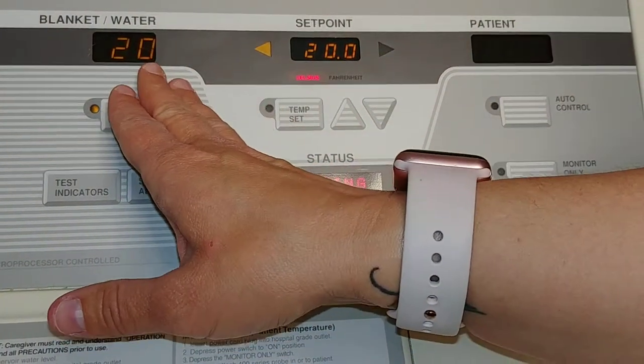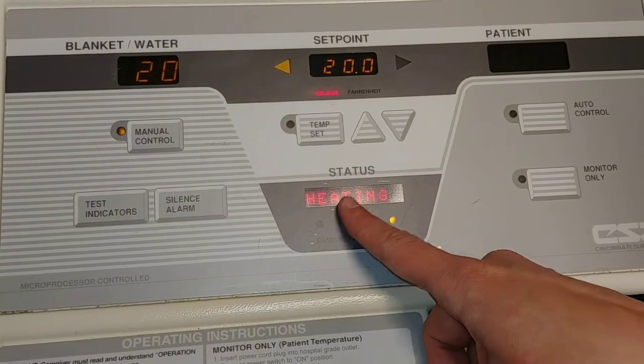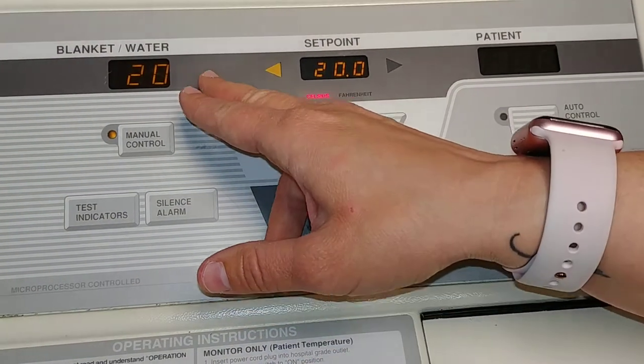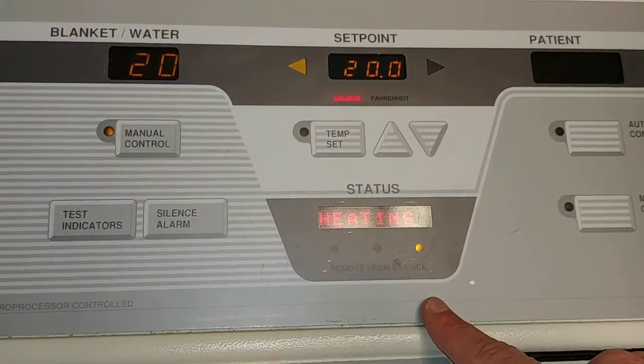If the water in the machine is above the set point — say 21 or 22 degrees — you would see the status say 'cooling.' If the water temperature is lower than the set point, then you would see it say 'heating.' That's how to use this machine.